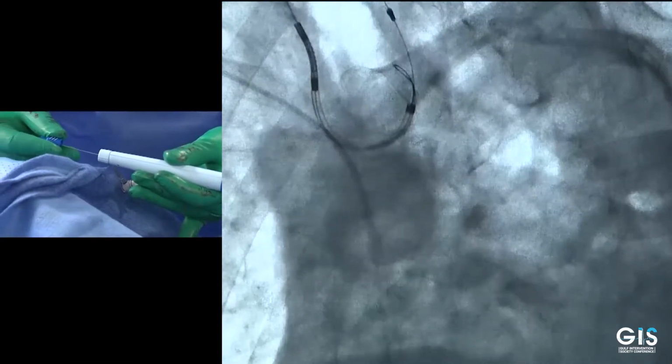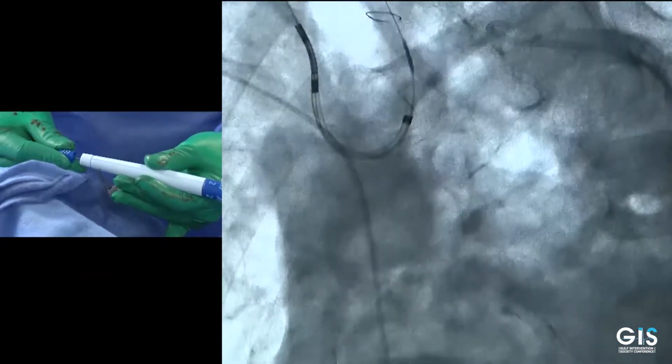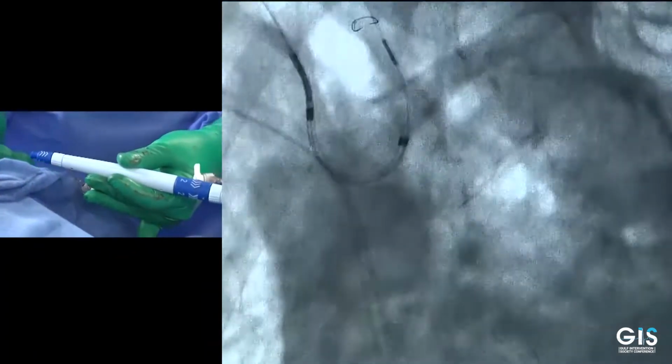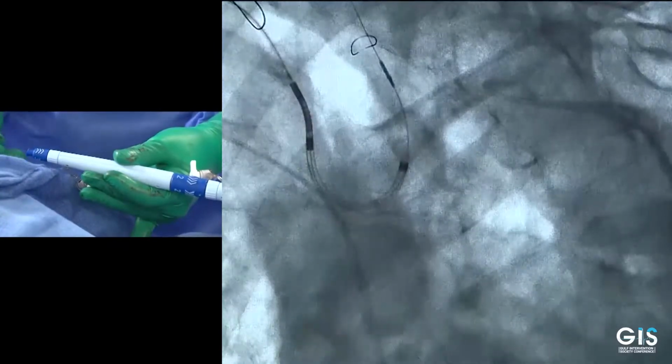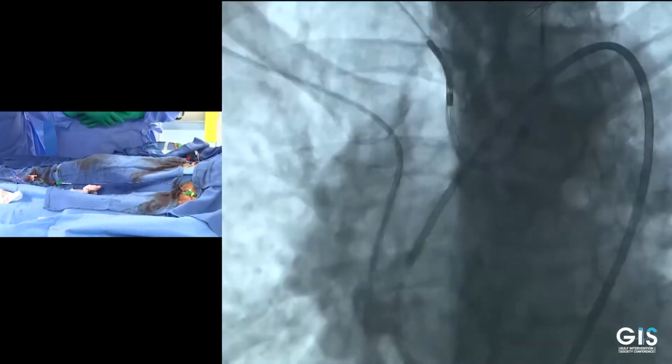Go ahead, Dr. Fahad. Okay, you can see it on the screen coming up nicely. Keep going into this position. Okay, keep going a little bit. Okay, fantastic. This is a very good position. And now we're moving along with our case.